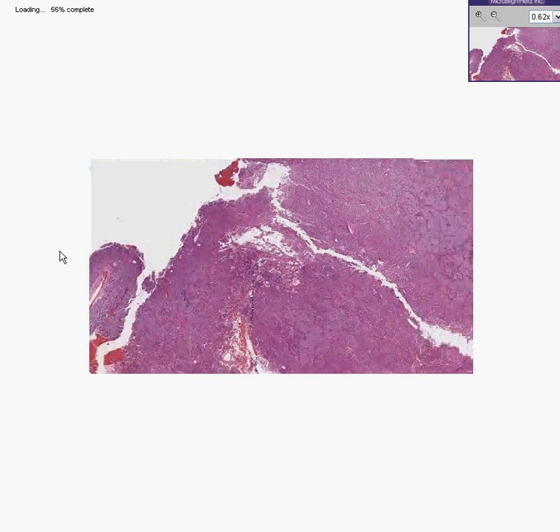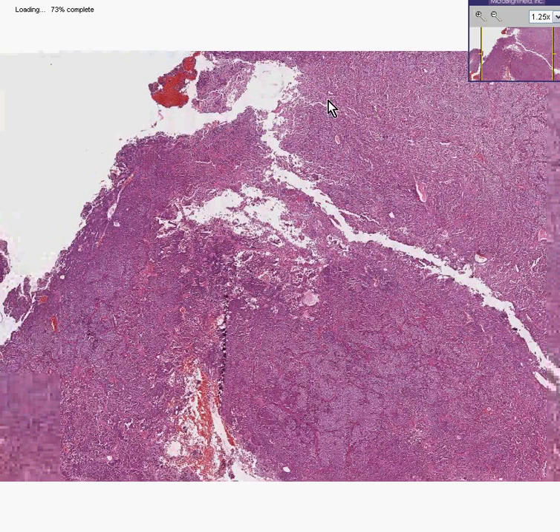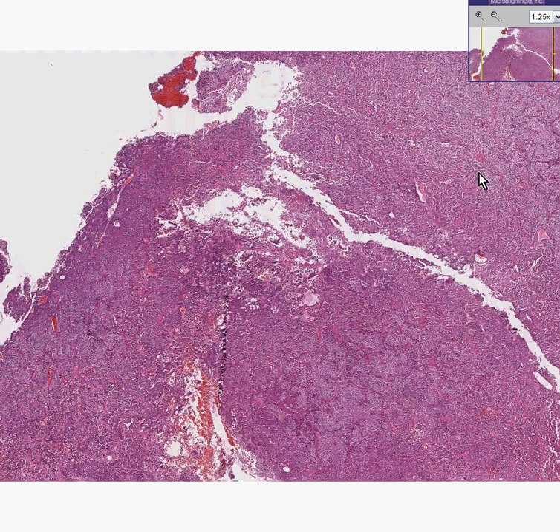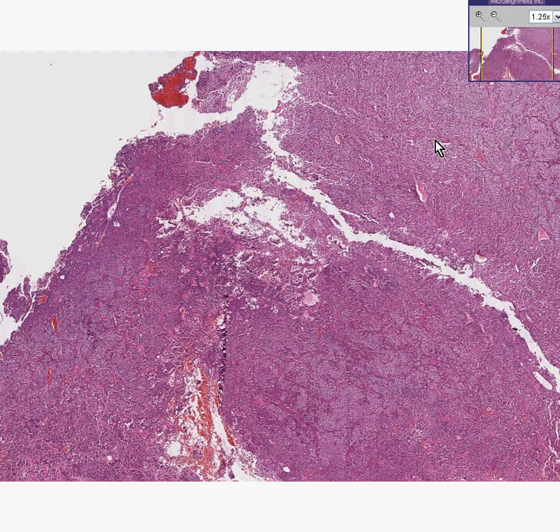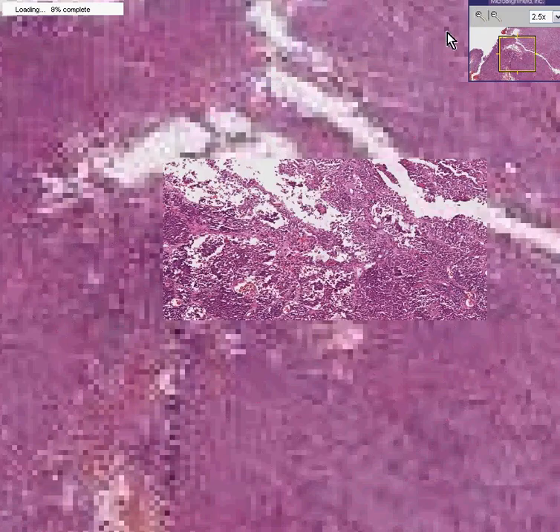Let's look at it microscopically. You can see that, like many tumors, it's basically a uniform proliferation of essentially one kind of cell. The pituitary has an anterior lobe and a posterior lobe. The posterior lobe looks like brain tissue and the anterior lobe looks like glands, and almost all the tumors arise in the anterior lobe.